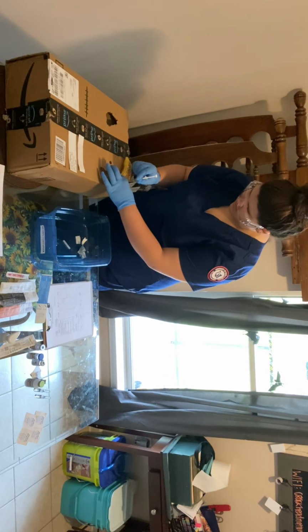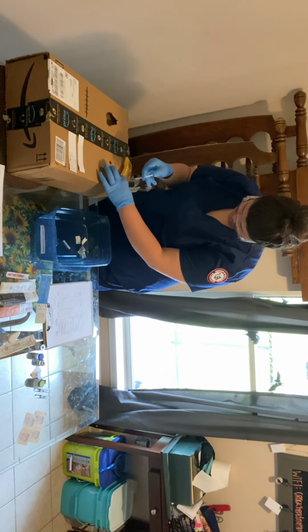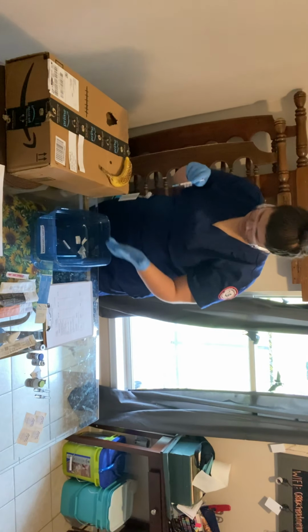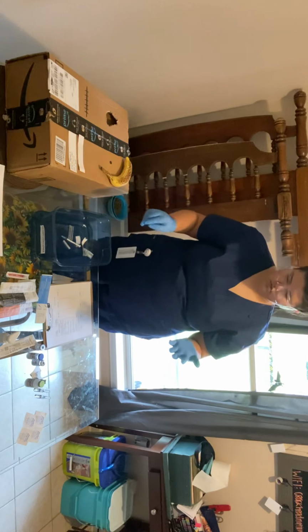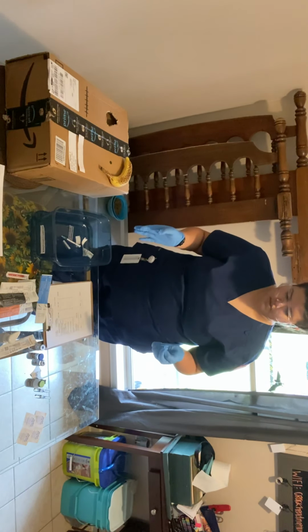And while keeping it pinched, I'm going to inject the heparin. And then remove the needle and release the skin. I will put the needle and cap both in the sharps container.